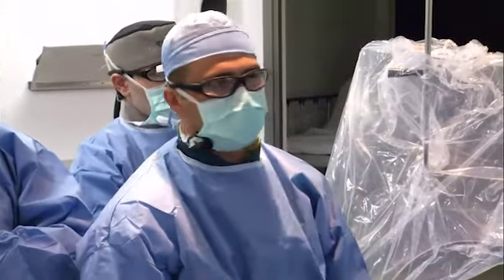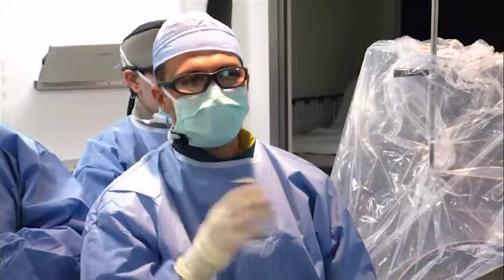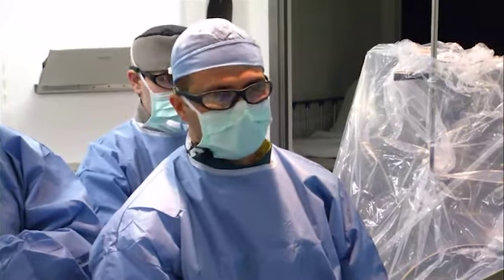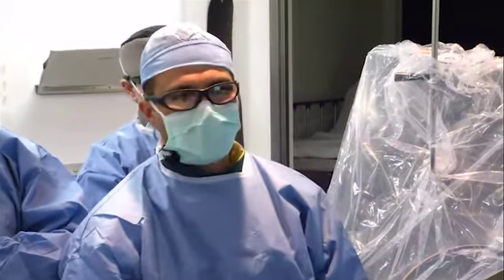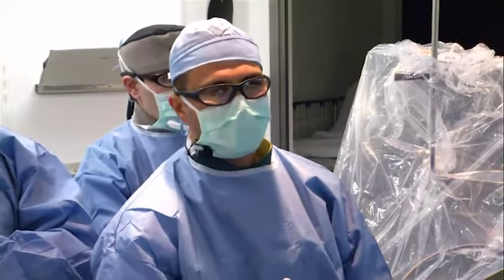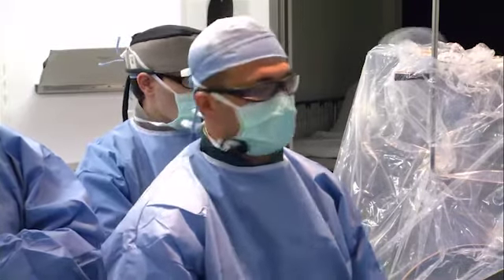So we are able to get the sheath across the bifurcation of the iliacs, but not down to the common femoral. Despite putting a stiff angled glide wire, putting a balloon in the profunda, and trying to rail it over the inflated balloon. So various techniques.